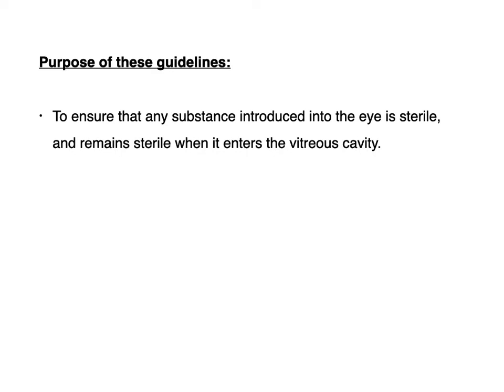Our aim is to deliver sterile drug into the eye and maintain its sterility. The most important tip is to avoid contamination of the advancing needle by avoiding touching the lashes or the lid margin before entering into the sclera.